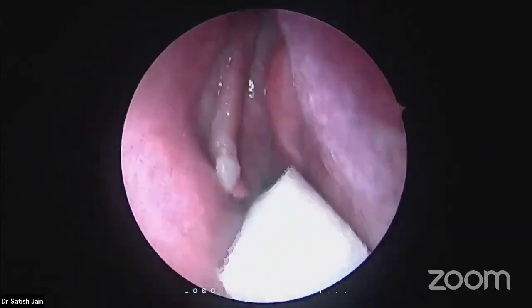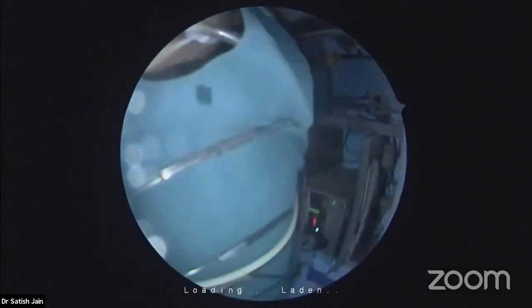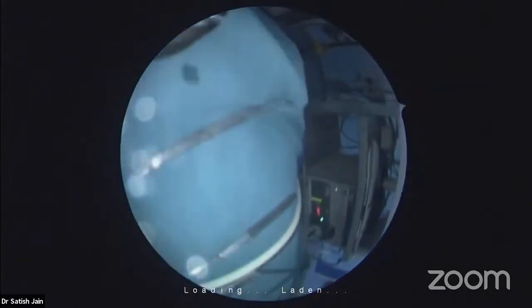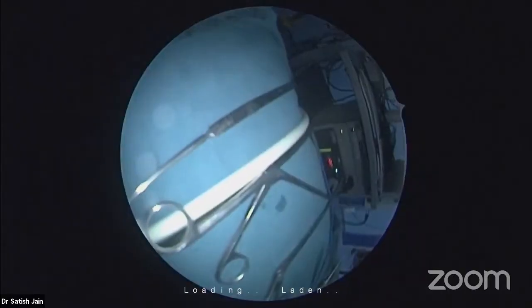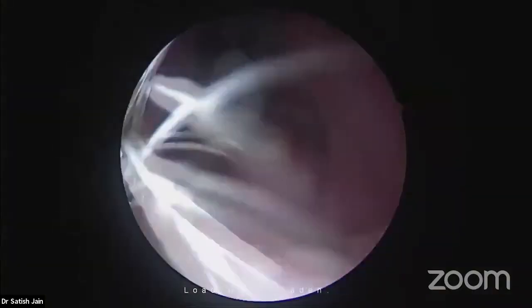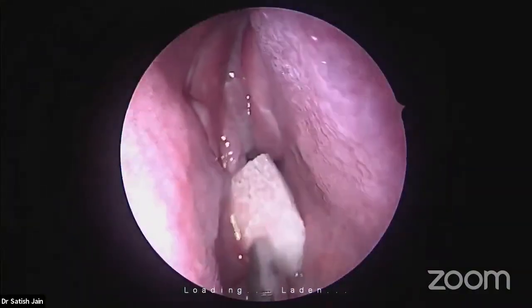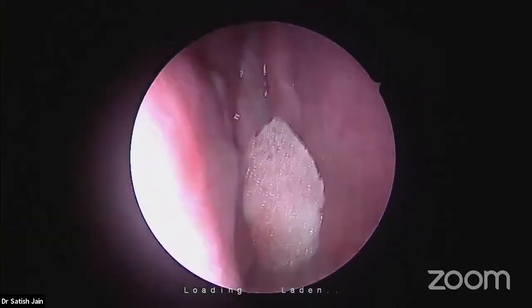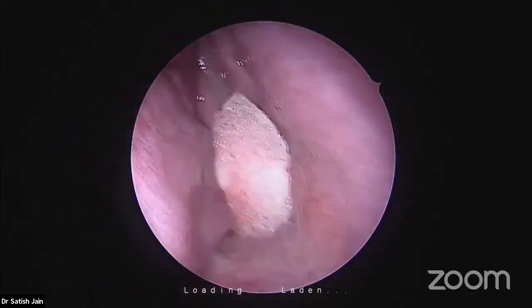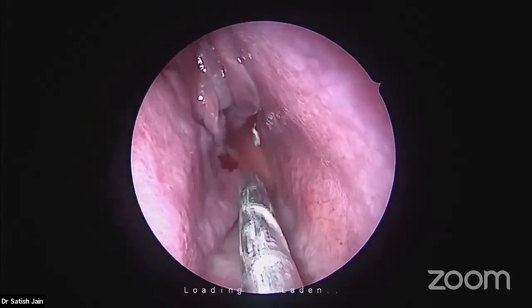Under local anesthesia in a wake-up patient, if you use a debrider, you can think of it as if somebody is running a drill in your head. How much discomfort one can expect. So the cooperation of the patient is a big problem sometimes. And third is the airway security. Now we are so secure about the airway with the intubation cuff, the throat pack, and then we leave another pack over here. There's no question of any aspiration.